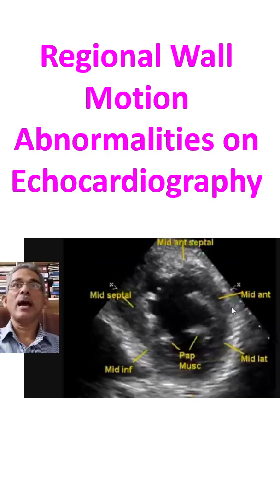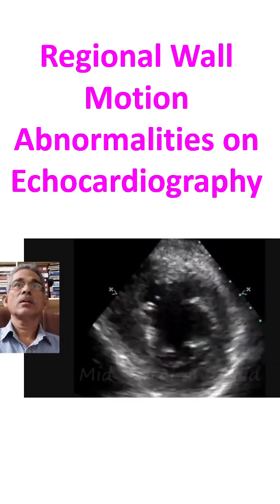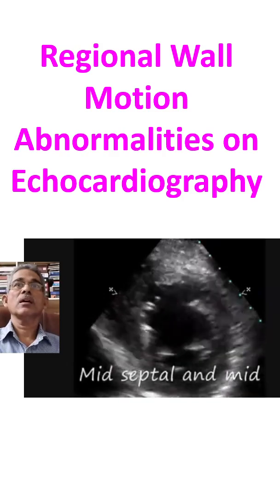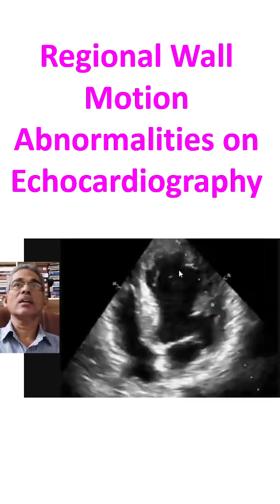This is the mid-anterior, this is mid-lateral, and you can see two papillary muscles here. This is the mid-inferior segment and this is the mid-septal segment. We will move the image. Now you can see the mid-anteroseptal hypokinesia well.